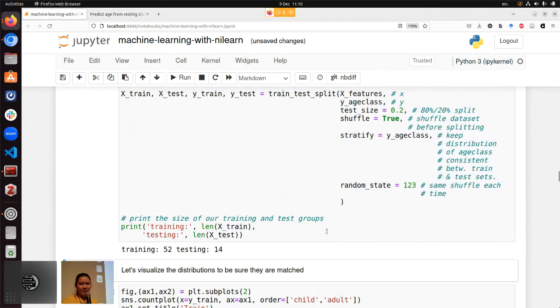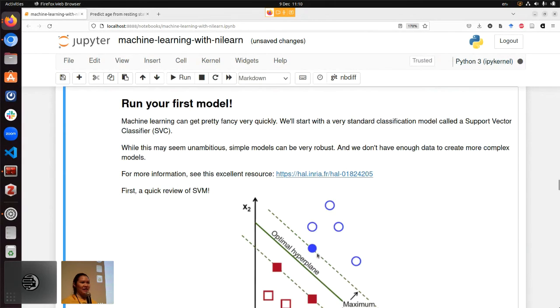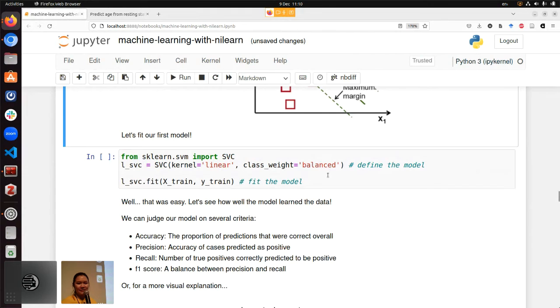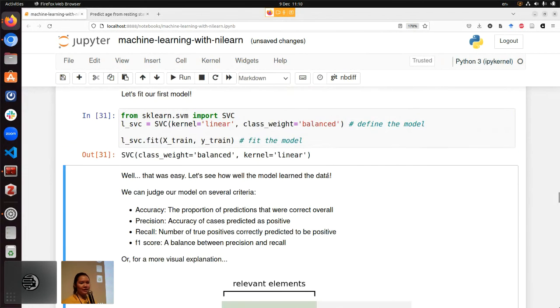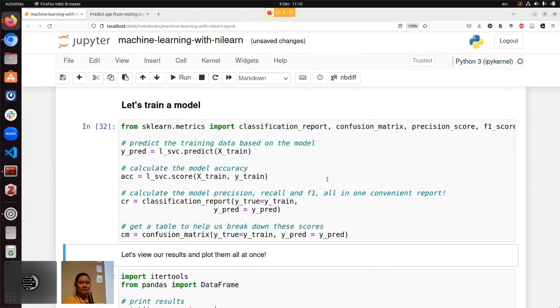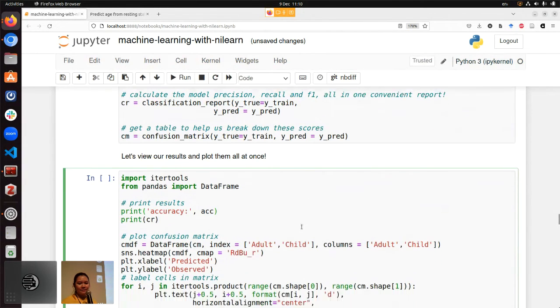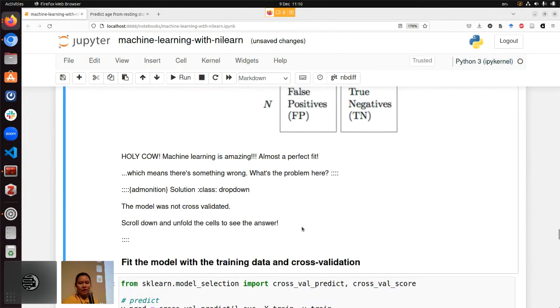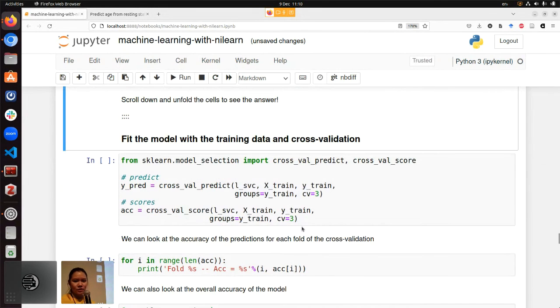So yeah, the situation of overfitting, I'm really glad I see a lot of people in the audience shaking their head, because it is indeed a very bad thing. When you're overfitting your data, that basically means you can do everything perfectly with the data you can see, but when you're throwing any kind of data that is outside of the training, you might run into issues. So in Scikit-learn, it is truly amazing. It has implemented a lot of functions to help us mitigate this without writing the actual code.